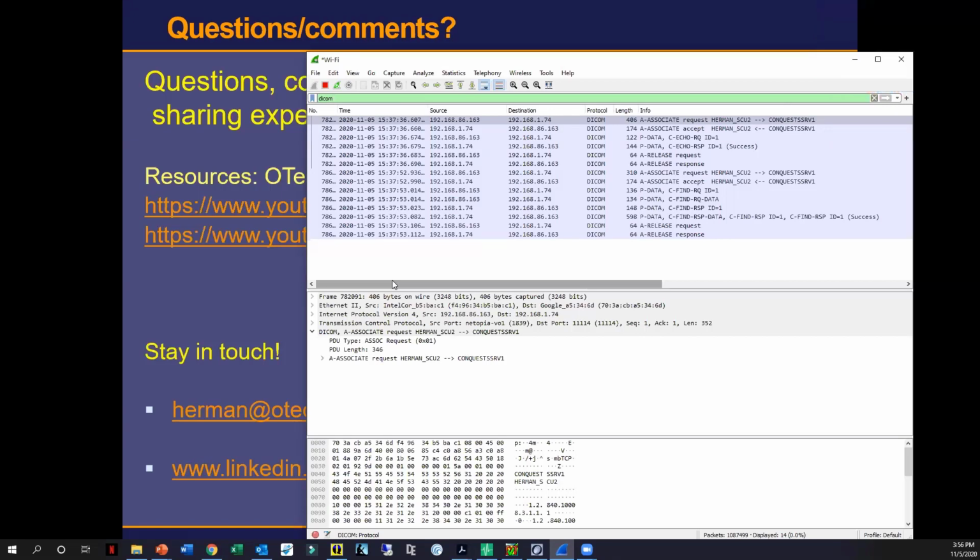Okay, next question. All right, this is actually our last question. How often do you see a cardiology department and a radiology department running separate MWL servers versus a common MWL server queried by department or system? I think most of the time you see separate. But that answer doesn't help you too much, because in your hospital you might have the same. The problem is more politics and policies, because cardiology has their own PACS administrator and their own budget. It came, for example, with their cardiovascular information system, so they have their own broker, and they might want to use it.